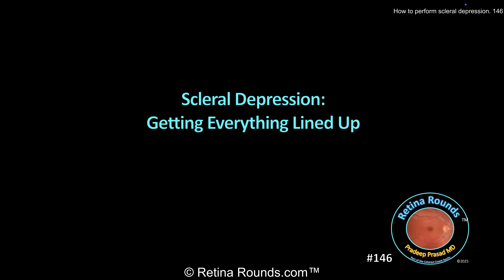Probably the most important thing to take away from this overview of scleral depression is the importance of getting everything lined up. The patient's gaze, your scleral depressor, and your eyes all have to be lined up in the same direction.